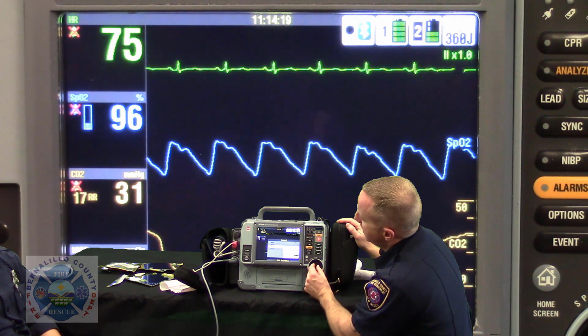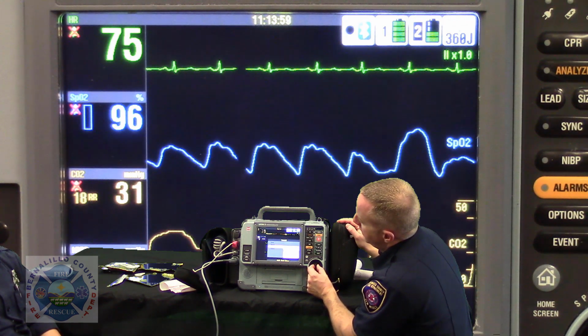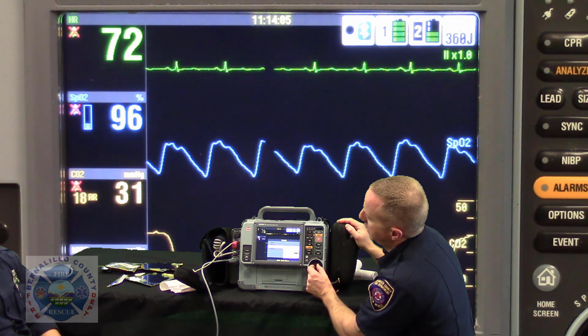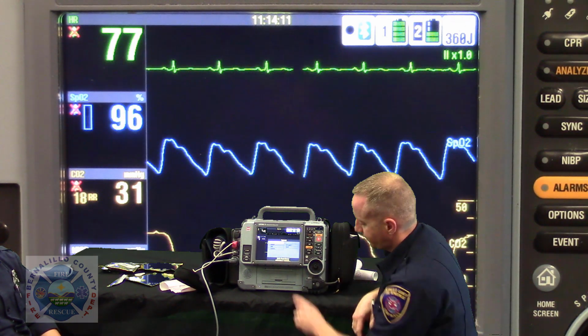We're going to pick our site, whichever hospital. You'll notice that the hospitals with cath labs are listed. So you don't want to send this EKG to an ancillary facility where the patient can't get the reperfusion therapy they need. And for the purpose of this, we're just going to send a test. And we're going to hit send.